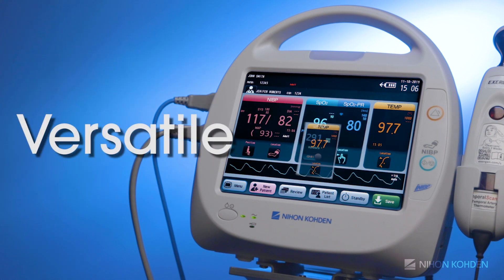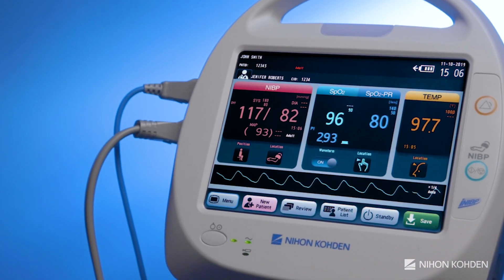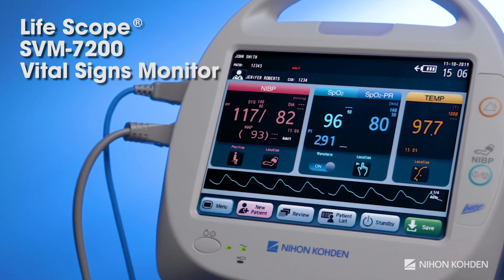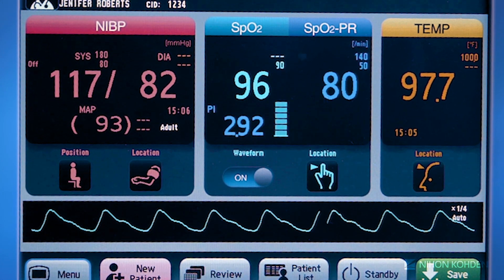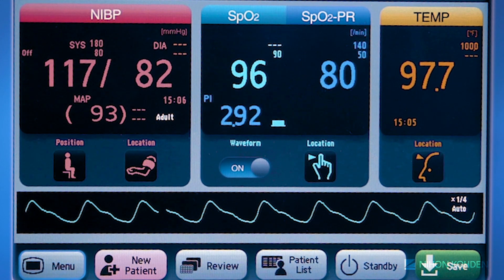Efficient. Versatile. Intuitive. NeonCoden's latest innovation, the LifeScope SVM7200 Vital Signs Monitor, maximizes healthcare workflow by allowing nurses and technicians to quickly measure, document, and integrate basic vital signs into patient medical records at the touch of a button.